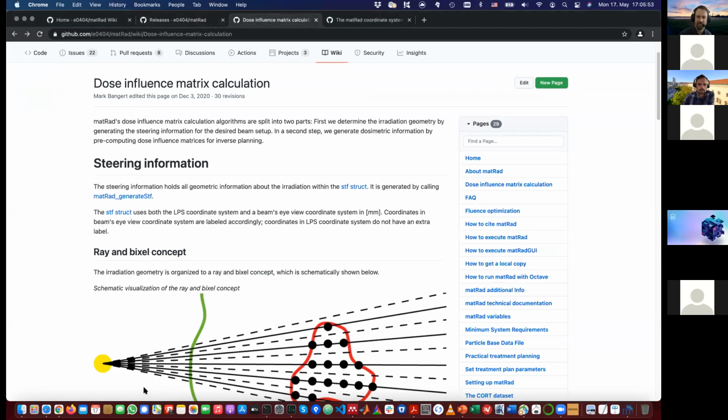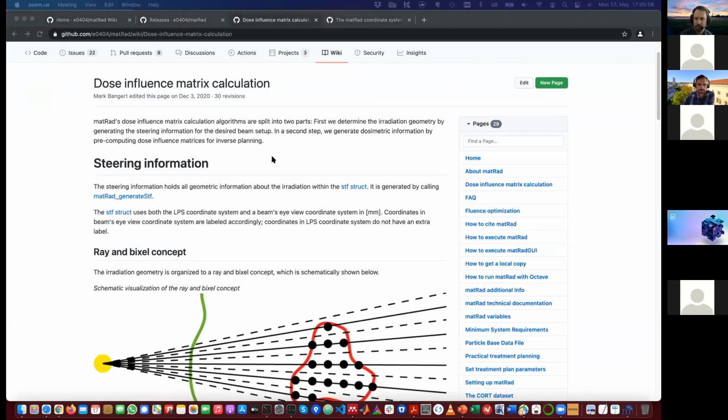Okay, so there are probably some people stuck at the download button right now. So now I really want to switch. It goes a little bit like ping-ponging now, but I want to switch to the ones using the code, while the others download the runtime in the background.